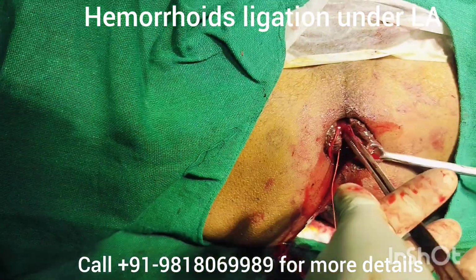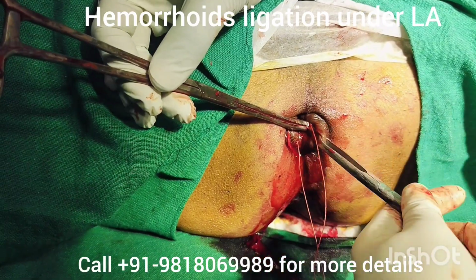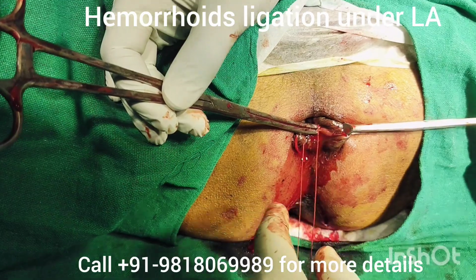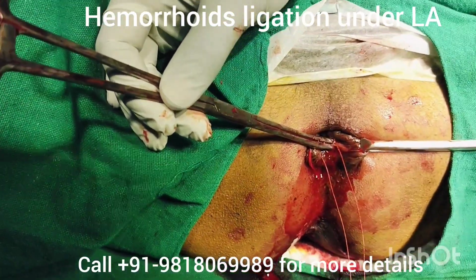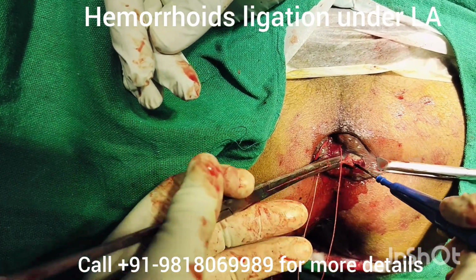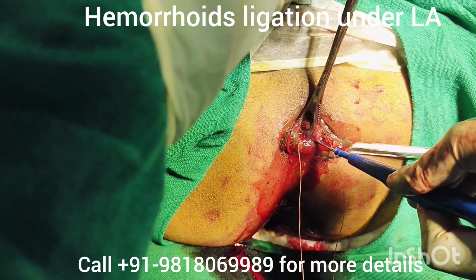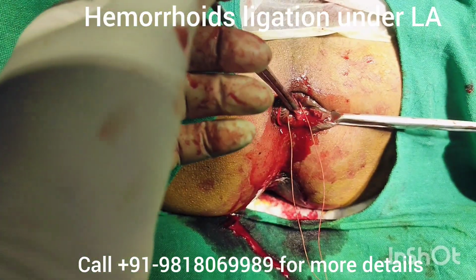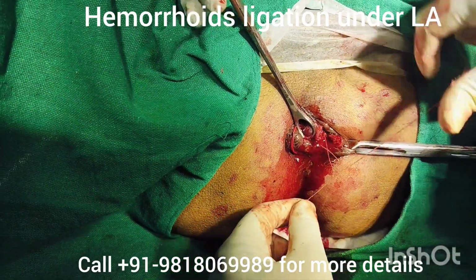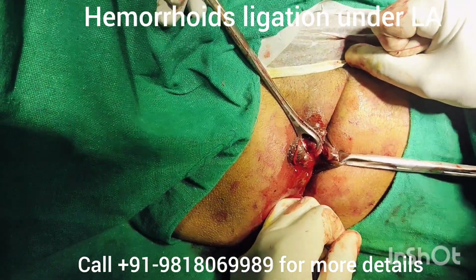Now we'll separate this mucosa from skin at mucocutaneous junction using cautery. Then again the lateral knot will be placed inside this groove which we have just created using cautery.